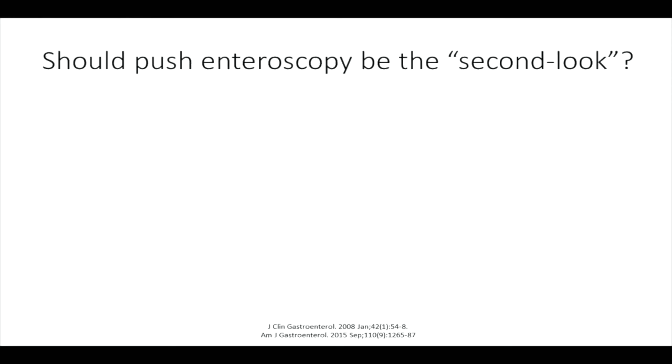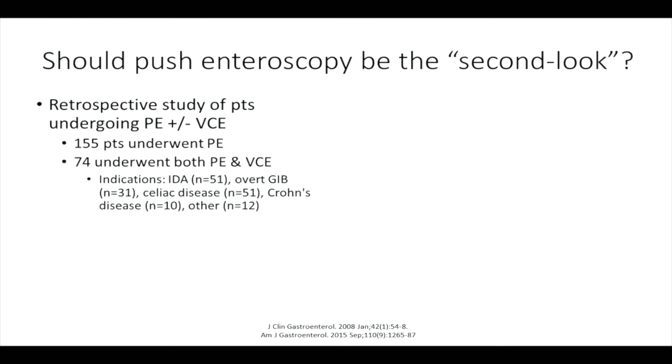So if you decide to do a second look, should you do a push enteroscopy? This comes up a lot. So a number of studies have looked at this as well. One of the more recent studies was a retrospective study that looked at patients undergoing a push enteroscopy with or without a capsule. They had 155 patients who had a push, 74 of them underwent both push and capsule. You can see the indications were quite variable, some bleeding indications, some other indications.